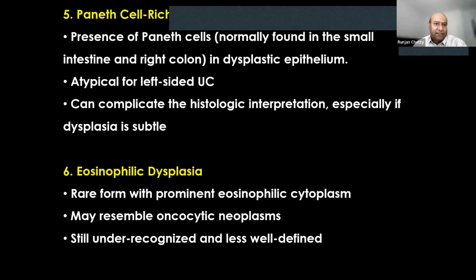And then just finally, to finish off, Paneth cell rich. Again, you've got a dysplastic lesion with loads and loads of Paneth cells, and they tend to confuse the issue because Paneth cells don't generally appear dysplastic in the setting of IBD. As I said, if you see Paneth cells, look again for a subtle dysplasia there.